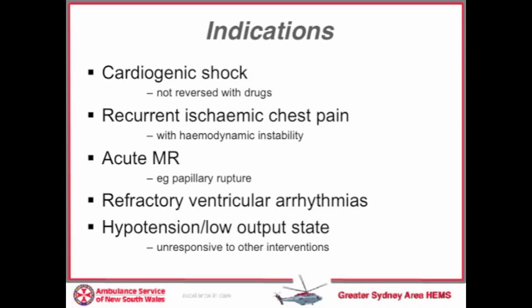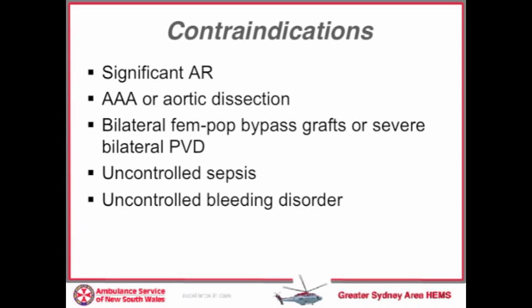Listed are some common indications for insertion of balloon pumps. We find that most of our patients are those with residual high-grade stenoses and therefore as a bridge to CAGs. Some contraindications are listed here, and these are fairly intuitive.